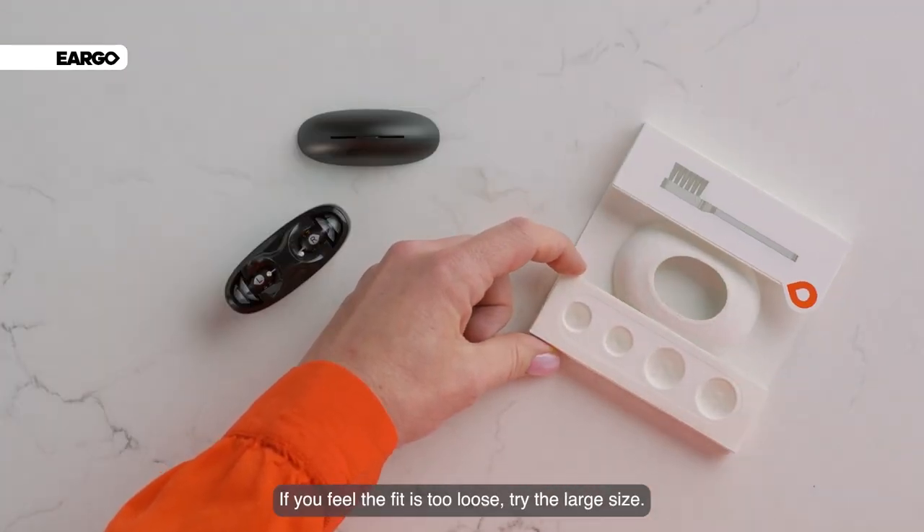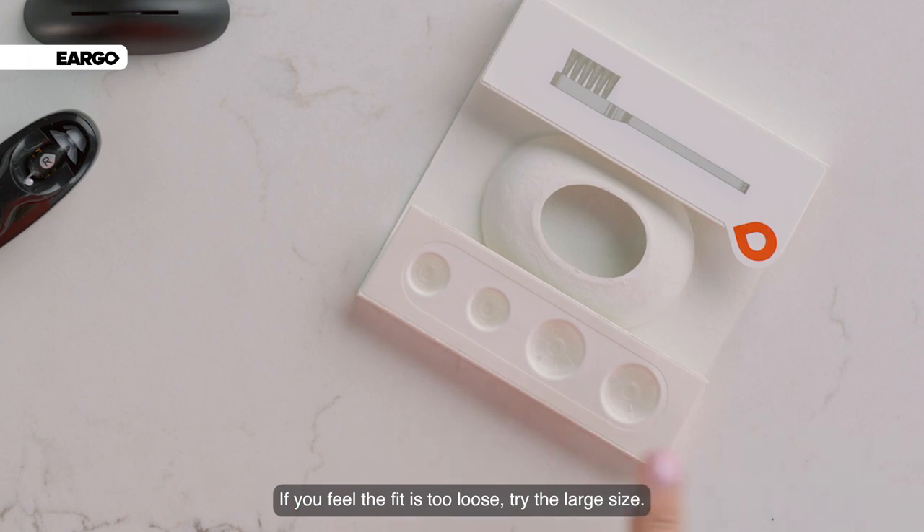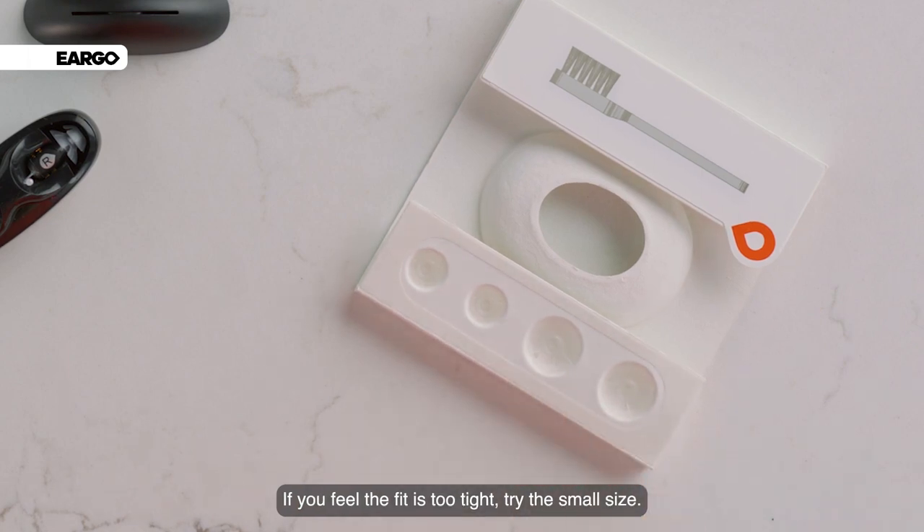If you feel the fit is too loose, try the large size. If you feel the fit is too tight, try the small size.